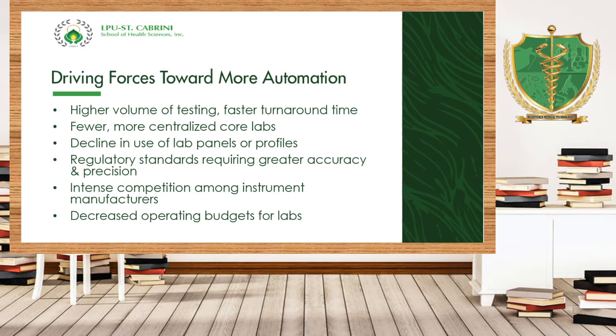Intense competition among instrument manufacturers is another reason. And we have here decreased operating budgets for laboratory. No, although it's costly to acquire machine equipment because it costs million. No, hindi lang siya thousand, million yan. One time, big time naman siya. Kapag po nabili mo siya, no, mabilis naman yung return of investment na tinatawag or yung tinatawag nating ROI.